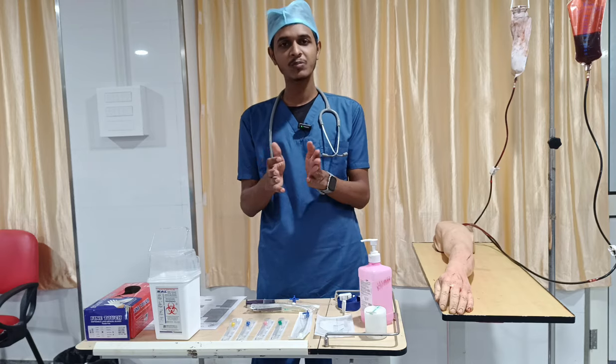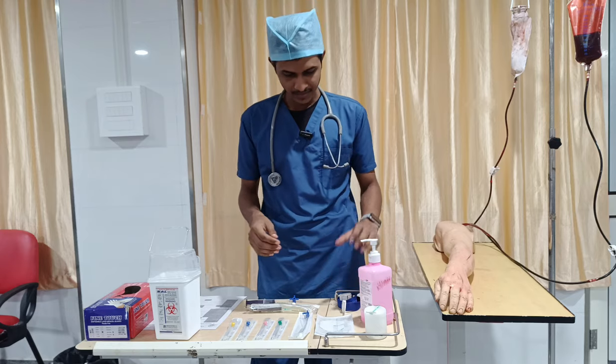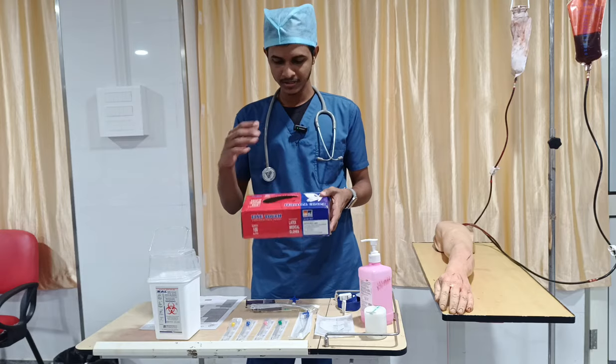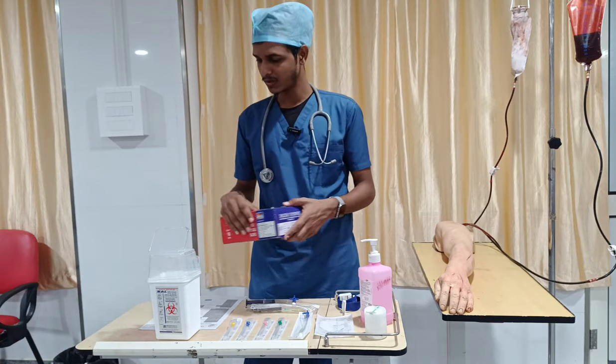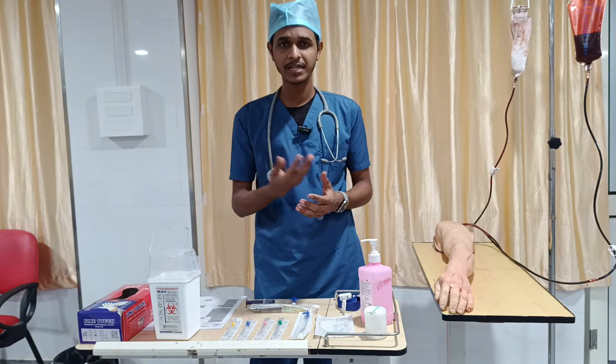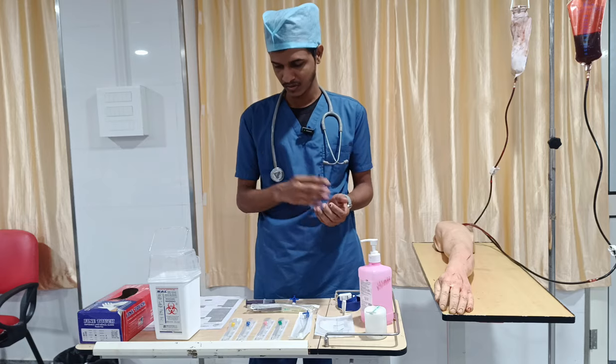What equipment and materials do we need? First, we start with the cleaning items. You have to start with personal protective equipment. Here I have gloves, and then you have to take a mask. If needed, a gown also. For a person requiring universal precautions, you can go with double gloves and get the gown also.